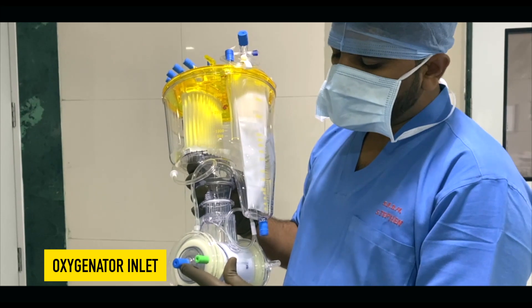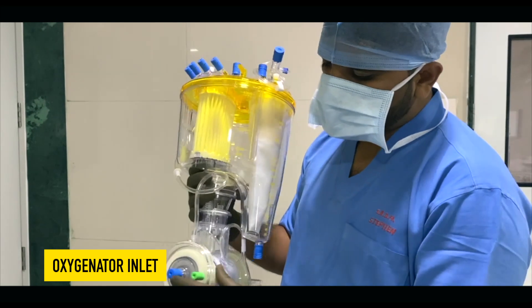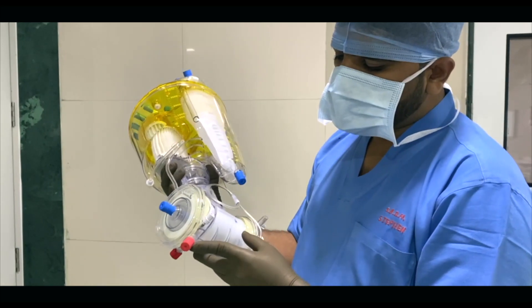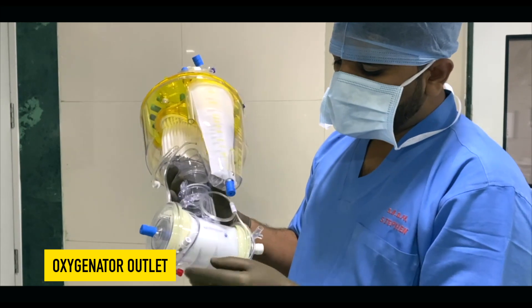This is the oxygenator inlet port, and just to the side of the oxygenator inlet port there is a green cap — it is called the oxygen line. Below the oxygenator inlet port there is a red cap — it is called the oxygenator outlet port.